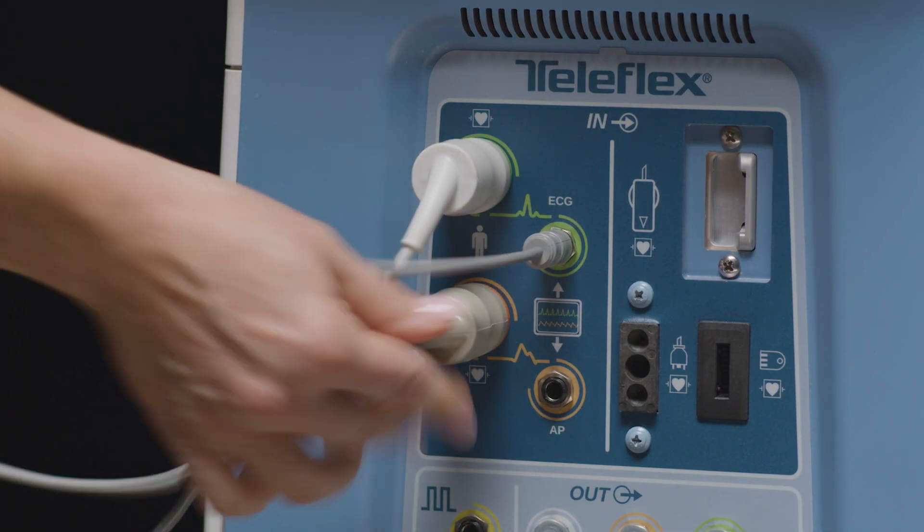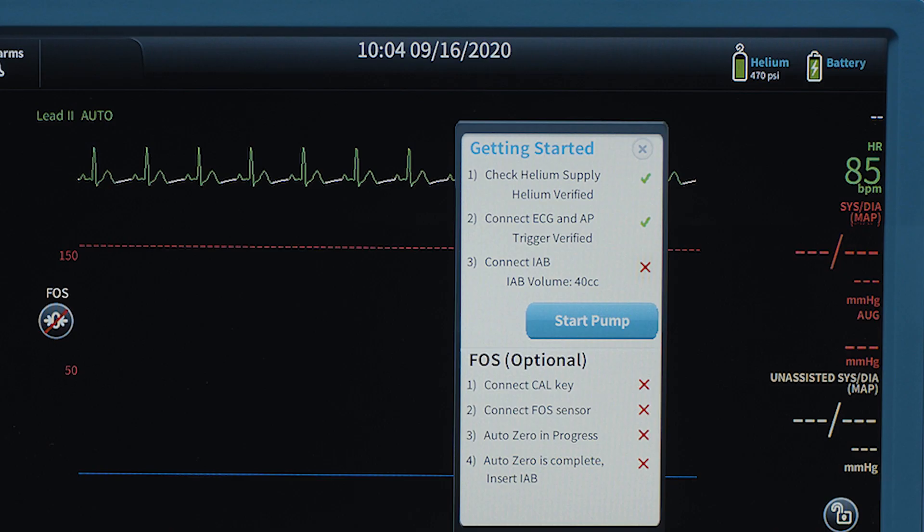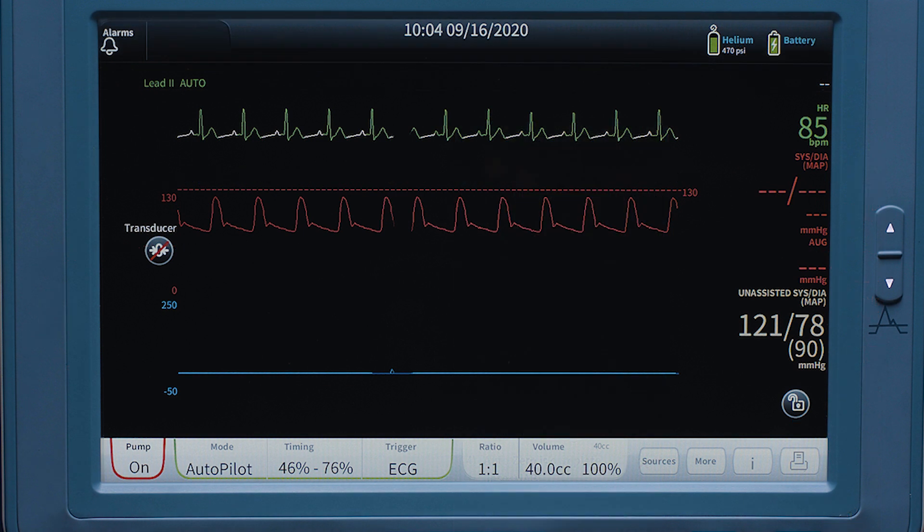Next, connect the transducer cable to the front of the pump. A standard pressurized arterial transducer setup will need to be prepared to connect to the central lumen of the balloon catheter and to the pump. It is recommended that you zero the disposable pressure transducer prior to starting therapy.